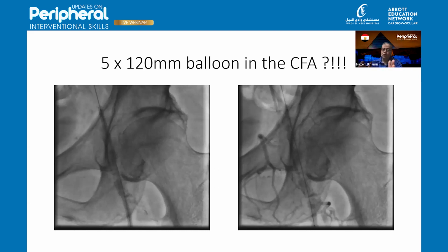A small balloon for the calcified lesion, to make a track, to test how this vessel can respond to the regular balloon, and you can upgrade the size according to the result of the small balloon. Because when you pass a wire in a totally occluded calcified vessel, this is a very good first step. Then upgrade the dilatation with a 5-0 balloon, especially in a calcified area near the big, precious profunda, for fear of distal embolization of the calcium to the distal bed and also to the profunda artery.